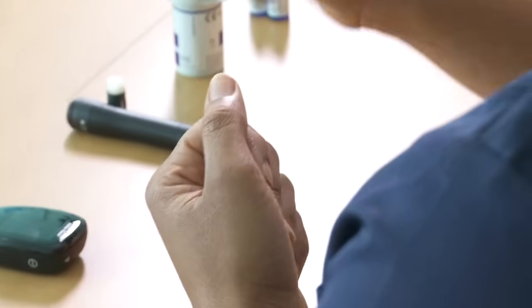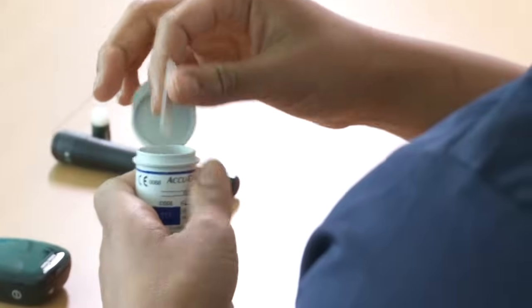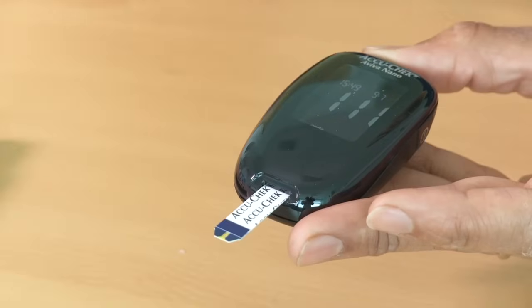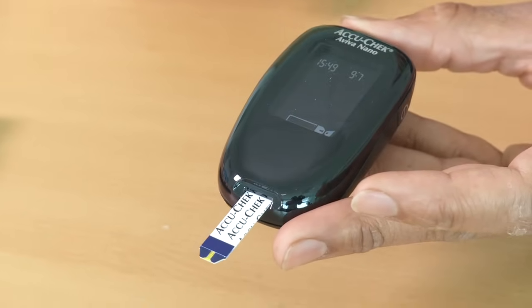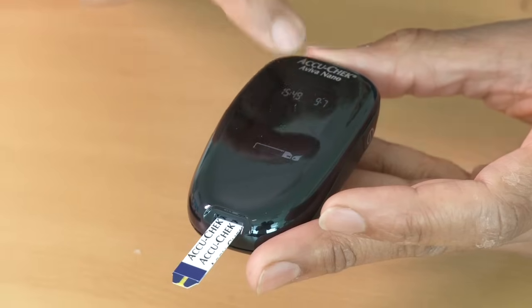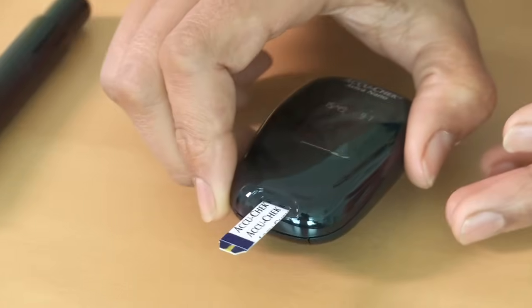Once you're happy that the finger is clean, you're going to place a strip into the bottom of the meter. Most strips have got a metallic end, and that's the end that goes into the blood glucose meter, which will just turn the meter on. You can see there's a picture of the strip and a drop of blood on the display, suggesting that you now need to put some blood onto the strip. Just place that to one side.